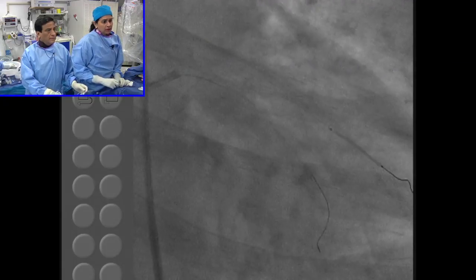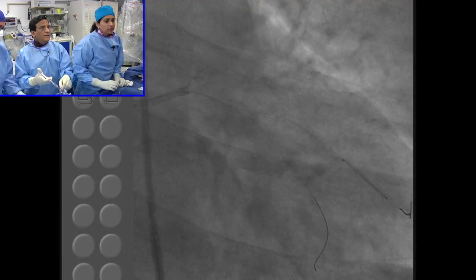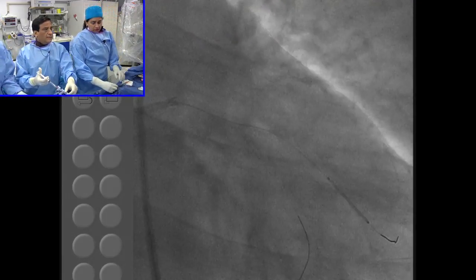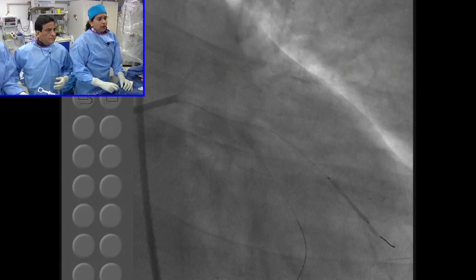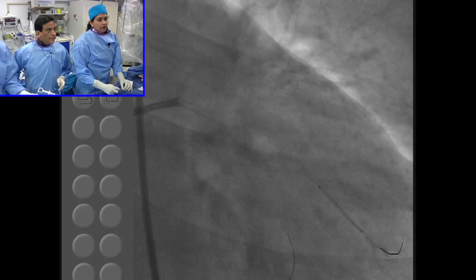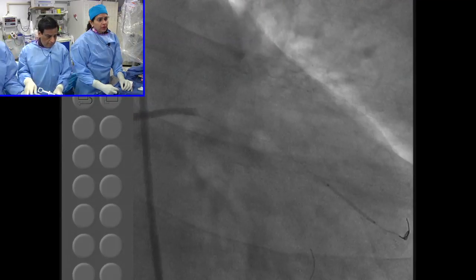Good. Done. You always pull back and try to go with the speed. No, too far. No, we don't want to. Wait. You're going to leave a gap, right? Yeah, that's fine. I think we are going to leave a gap. But pull back a little more. I think you're good now. Yeah. Okay, go.